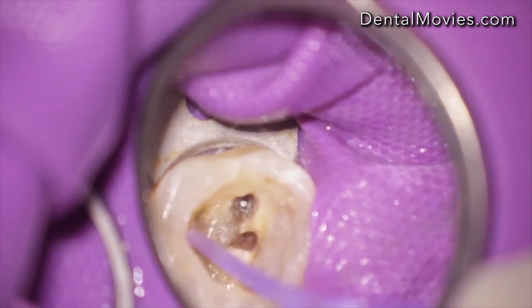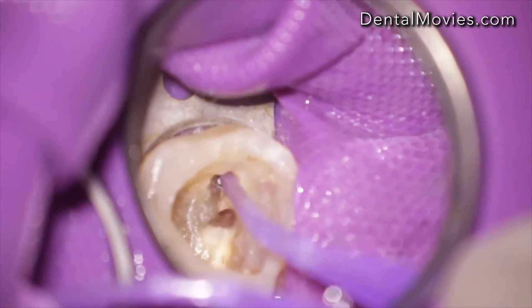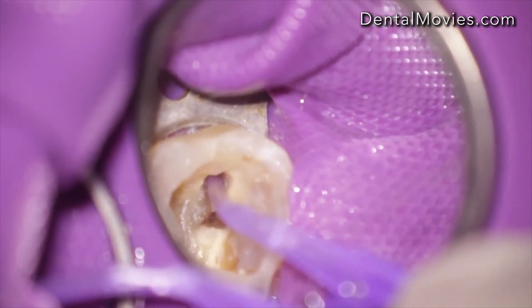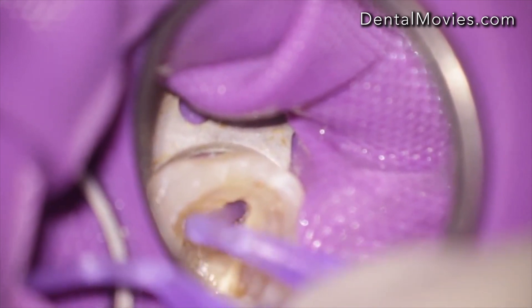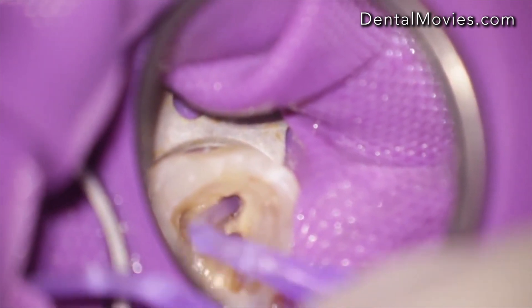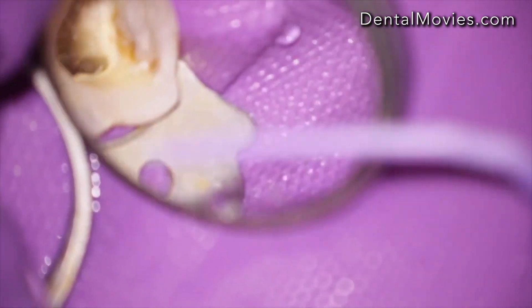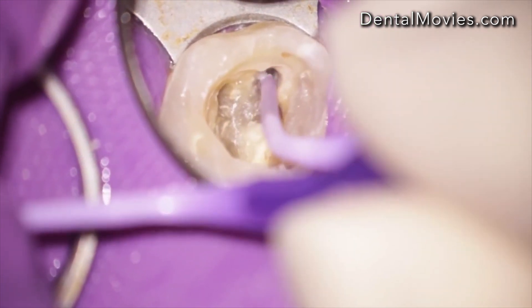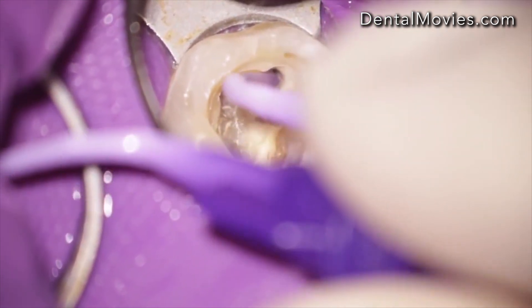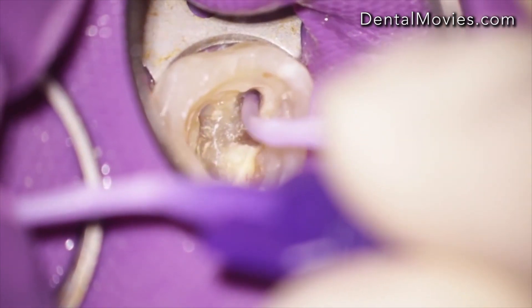I really like to use the capillary tip from Ultradent. You can cut the tip with a scissor so that it fits over the broken instrument. Then you can fill the capillary tip with a dual curing resin and place it gently over the broken instrument.